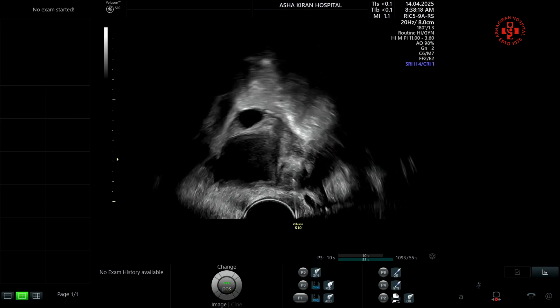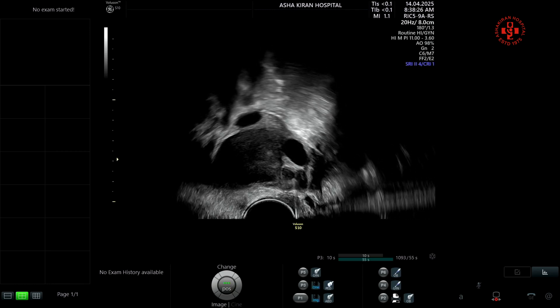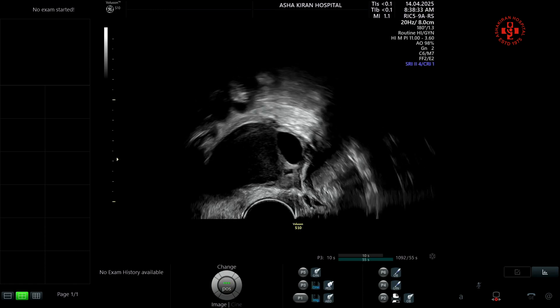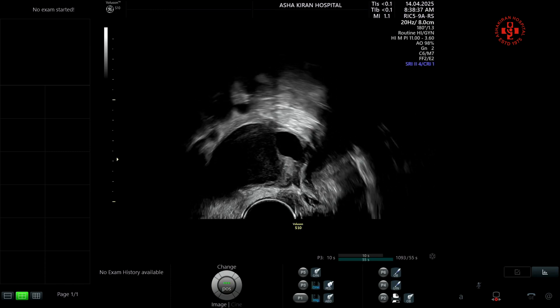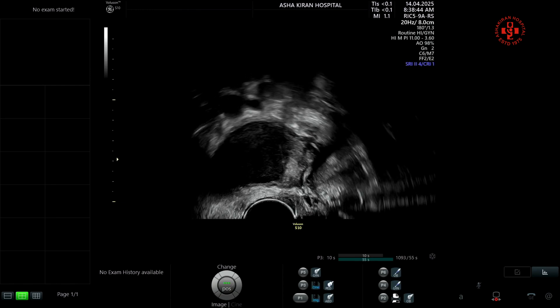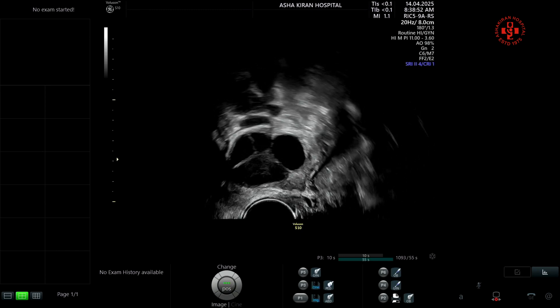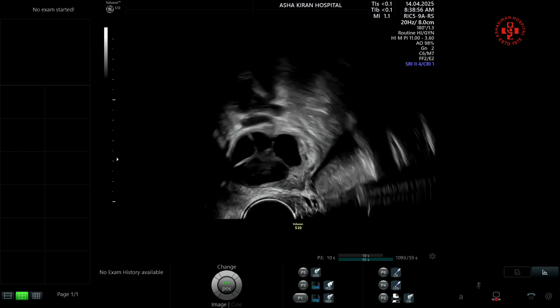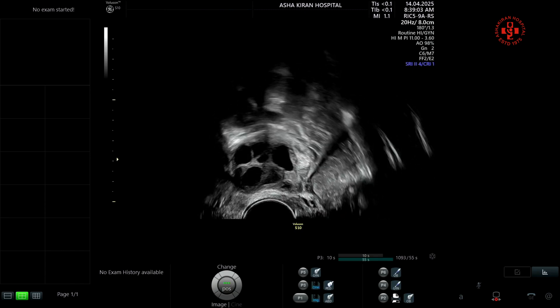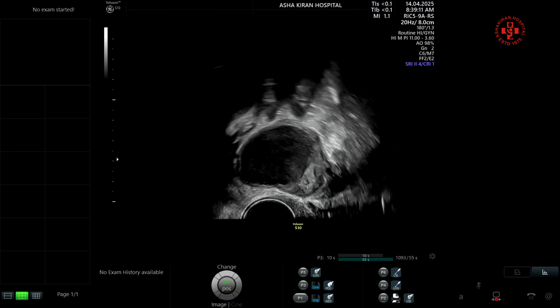Here again you can see we are assessing the ovaries, taking the needle down, identifying the peri-endometrioma follicles for follicular aspiration. You can see the movements of the hand and needle — exactly the technique we want. We are not disturbing the endometrioma. The suction pedal is activated only when the needle is in the center of the follicle. Once inside, the needle makes a slight corkscrew movement to access each follicle before activating suction.